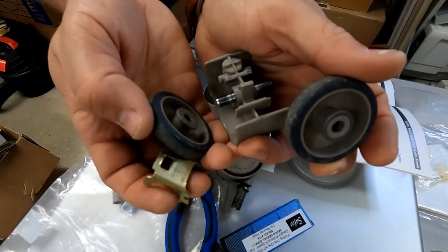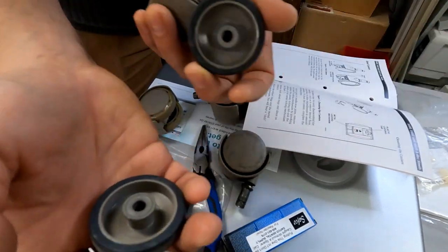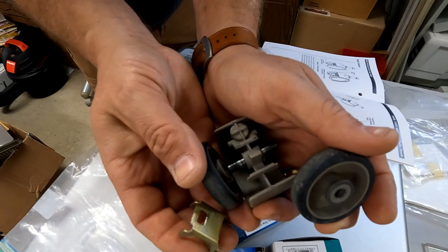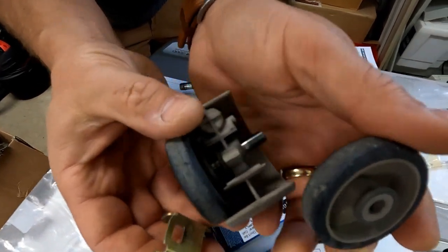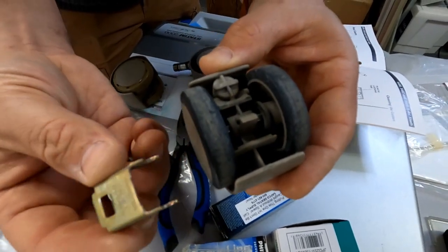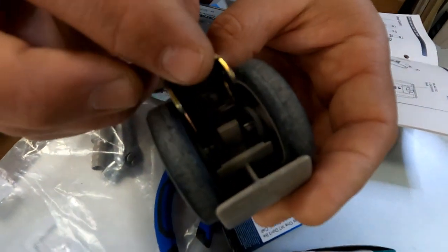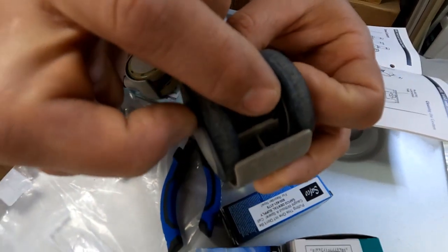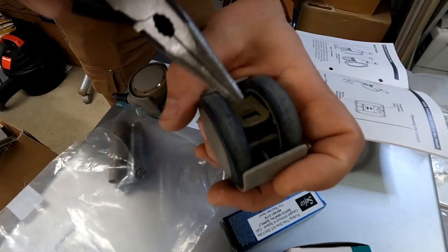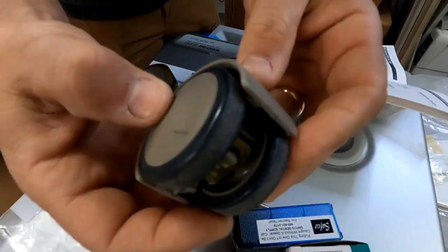Then to go ahead and put them back together, it says, well, step 2 is remove both wheels and clean them, duh. Now it says replace the wheel rings and the metal locking mechanism. So here we go. We're going to put that back there, and we're going to put that back there. And then the metal locking mechanism has these little arms on it. So they're going to go in this position here. Okay. And then we're going to push the wheels back in. And then all we're going to do is take our pliers again, and we're just going to push this down till it locks, just like that. And now the wheels are done.